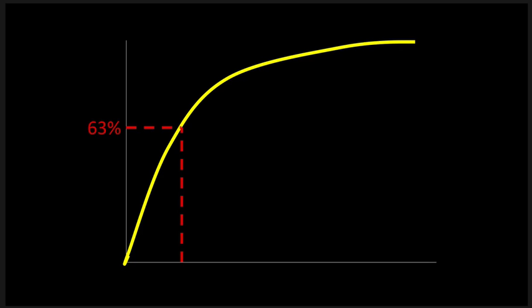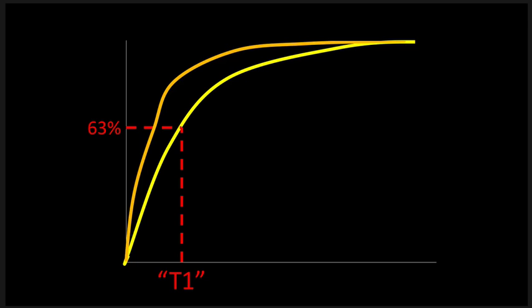So, again, if you've got something here, that's how we define T1 signal: as the recovery to 63% of its potential. If you get something that does that quicker, like that, it's considered to have done it quicker, in a shorter amount of time. It got T1 shortened, that's brighter. So when people say there's intrinsic T1 shortening of the pancreas, it means it's bright. It's bright on its own. Gadolinium works by shortening T1 effect, right?